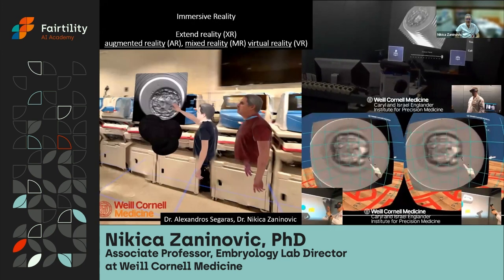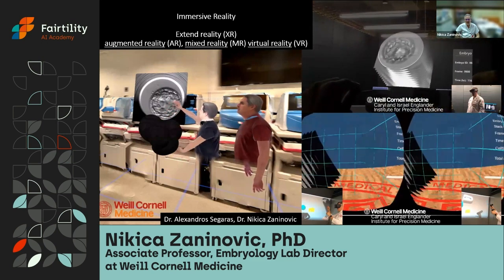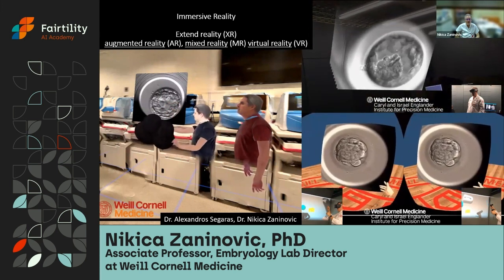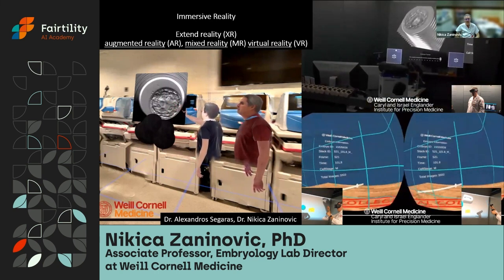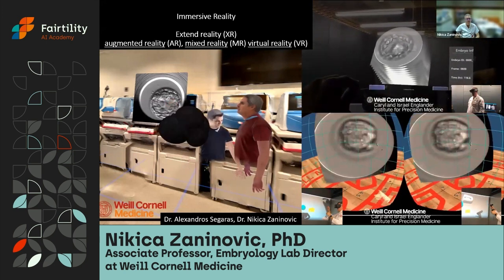But there are other things that I'm looking forward to and I'm trying to also get involved in. It's what I call immersive reality. It's actually extended reality, which means that you can take virtual reality and put it in real life, like in the laboratory, or you can take real life and put it in the virtual world. So using augmented reality, mixed reality, or virtual reality.